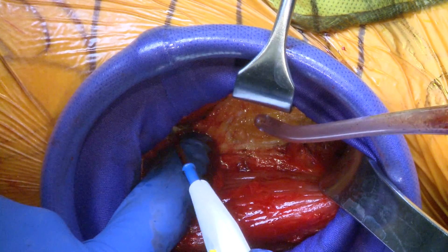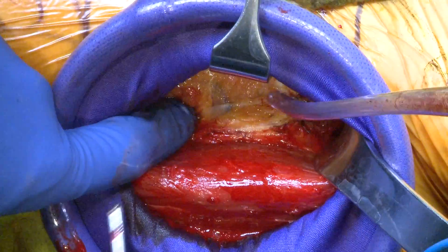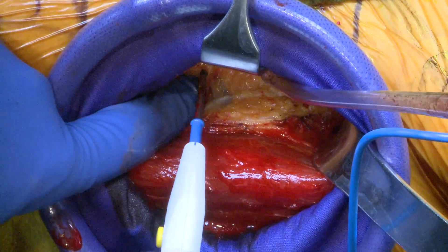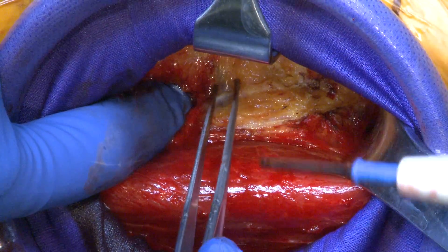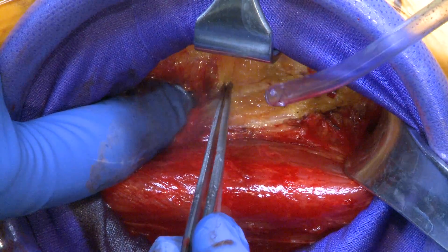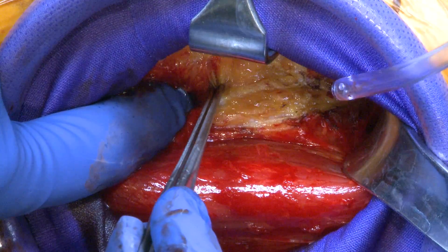Just completing mobilization of the rectus musculature — you can see these vessels right here. Those are the lateral femoral circumflex vessels. These can either be ligated or cauterized; I prefer cautery, but they do have to be done completely.